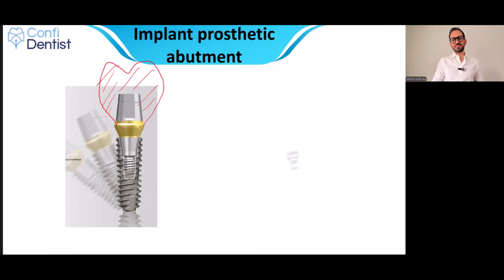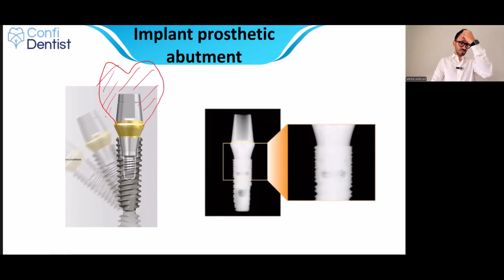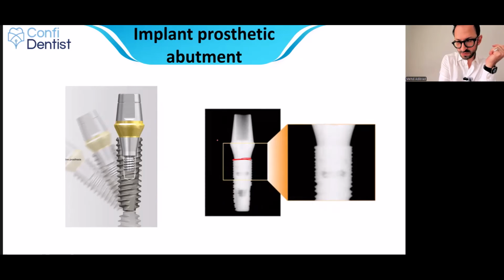Okay, and this is how it looks on the X-ray. Implant fixture, implant prosthetic platform. So implant fixture, prosthetic platform. And then this is the prosthetic abutment.